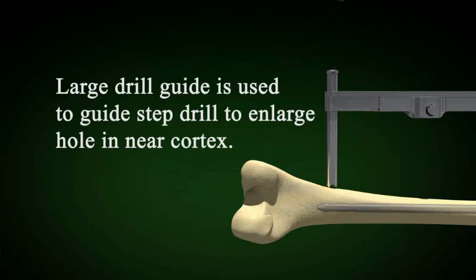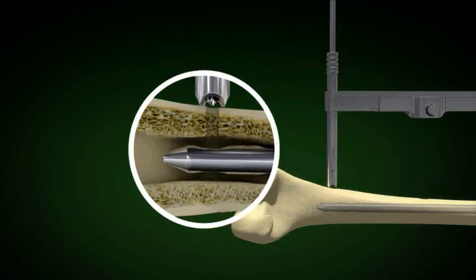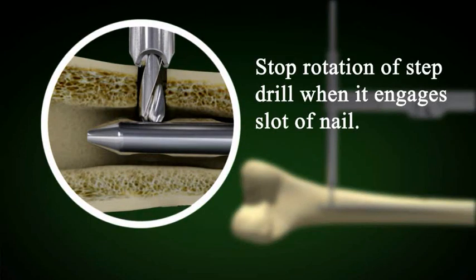The hole is then enlarged using the step drill and the large drill guide. Note the step drill as it proceeds through the cortex. It is important to follow the pilot hole, or the step drill will not proceed. When the step drill engages the slot in the nail, stop — you will make the step drill dull if you continue to twist.